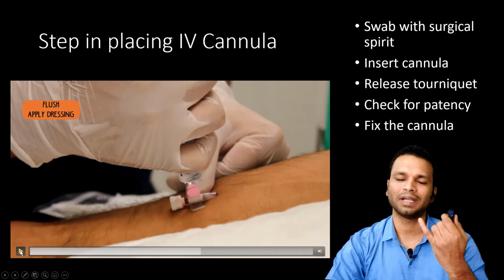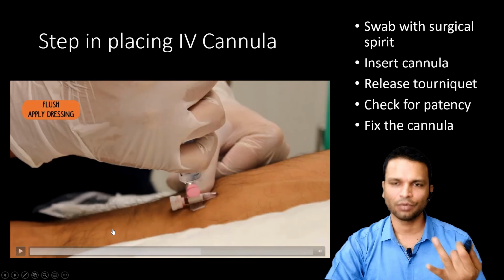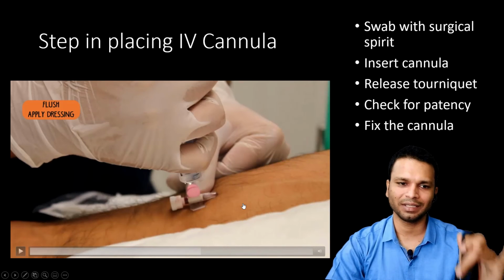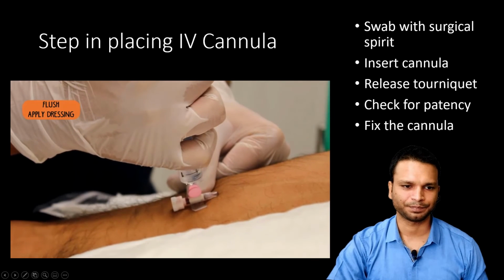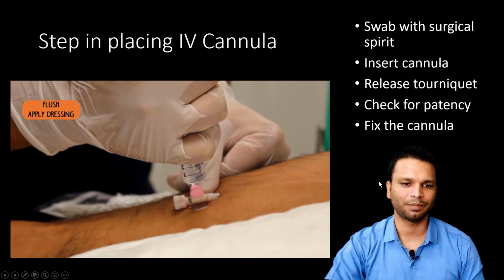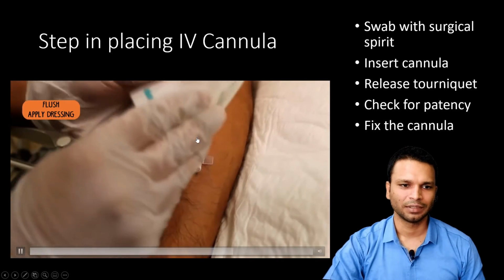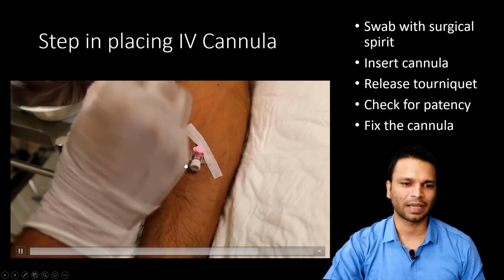So the patient will not feel any pain if the IV cannula is inside the vein, and there won't be any swelling. Whereas if the IV cannula is outside the vein, the patient will feel pain and the swelling will be seen clearly at the site of IV cannula placement. You can see the solution being pushed in and the patient doesn't feel any pain, no swelling is seen. So this is a good sign that you are inside the vein. Now I'll fast forward, you're going to use the wings to fix the cannula to the skin.